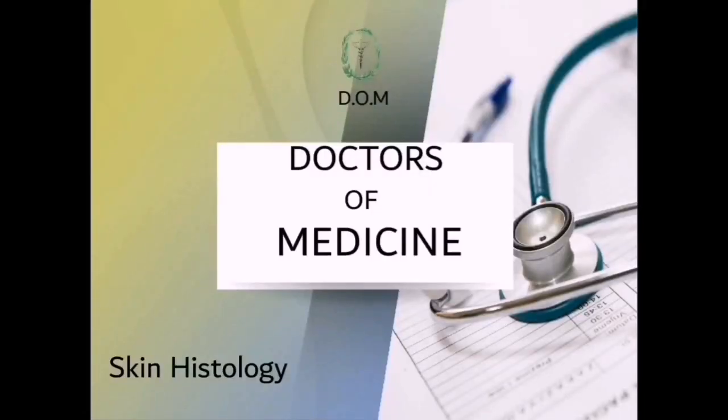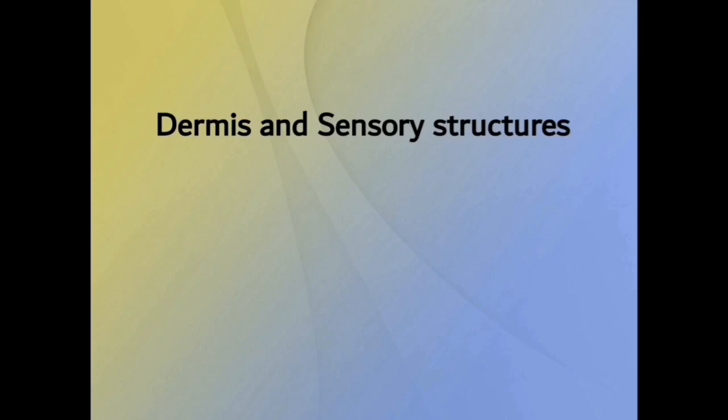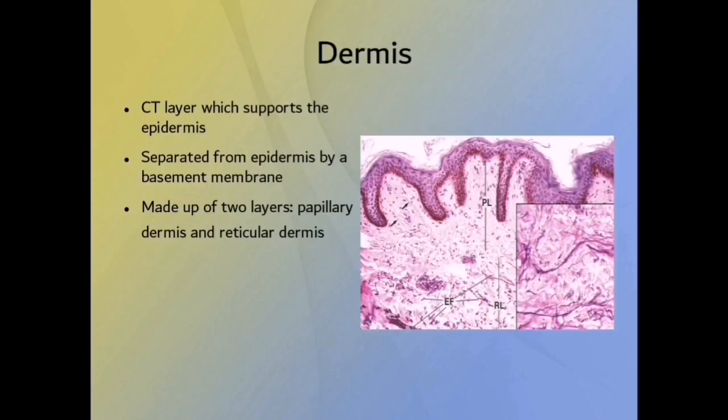In this video, let us now talk about the histology of the dermis and the sensory structures. Okay, so the dermis is the connective tissue layer which supports the epidermis. You can see it here, just deep to the epidermis.